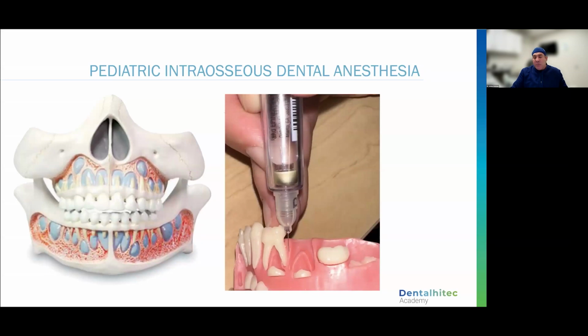So let's get into some of the pearls for tonight. There was a post a while ago, and this still comes up, that dentists were worried about using a needle for delivery of intraosseous anesthesia for children. We need to remember that these needles, the ones we're using 99% of the time in our pediatric practices, are 9 millimeters.